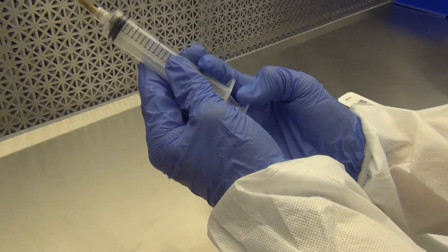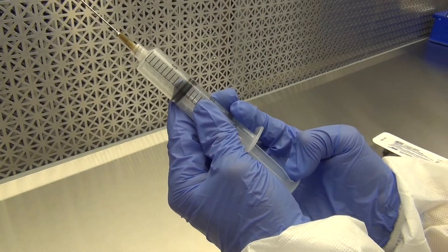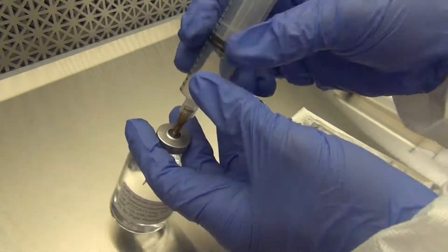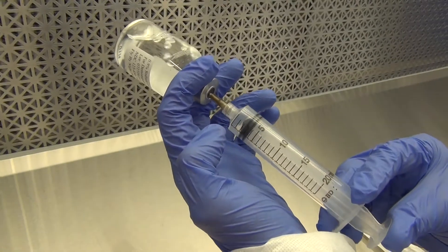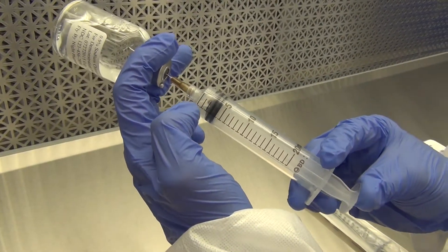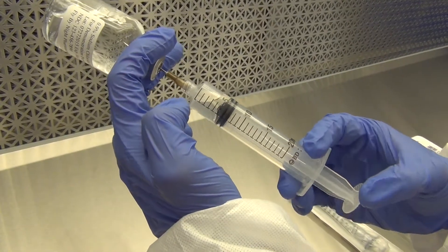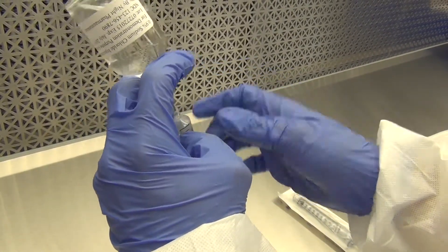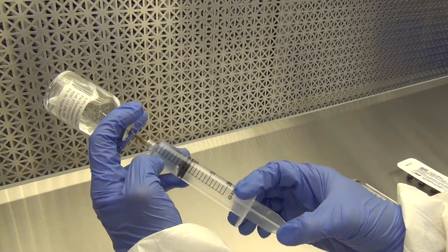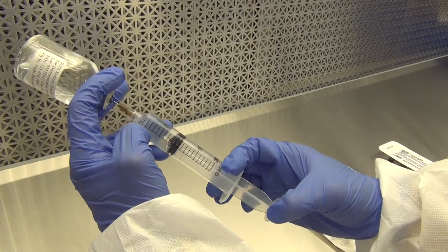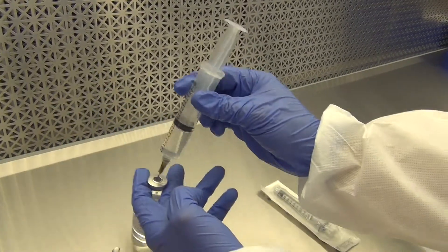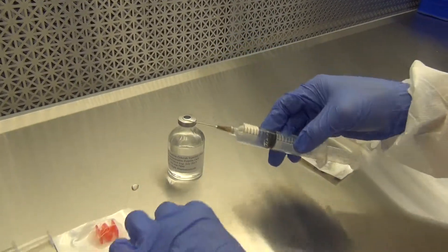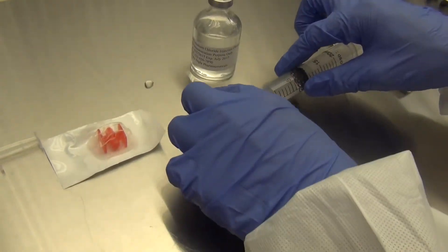Withdraw an amount of air equal to the amount of sodium chloride that you are going to withdraw from the vial. Again, use the anti-coring technique when going into the vial. Push the air in and remove the sodium chloride that you need. Try and position your hands so that you are not blocking first air. Recap and remove the needle from the syringe.